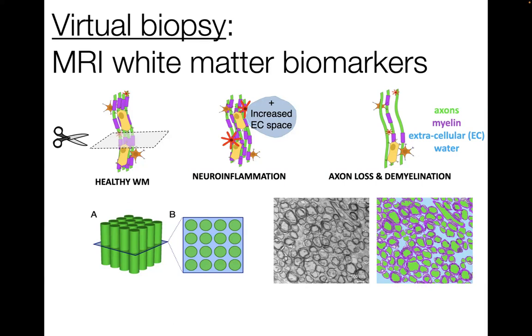In reality, well, it's not that different. Okay, here you can see the light of axons is in gray. The myelin is in dark, and here I Photoshopped the result. So you can see the extracellular water in blue, the green are the axons, and the myelin sheath in purple. So if I have good models and good data, I can estimate fiber density, how much axon in my pixel, how much myelin in my pixel, right? And how much free water in my pixel.